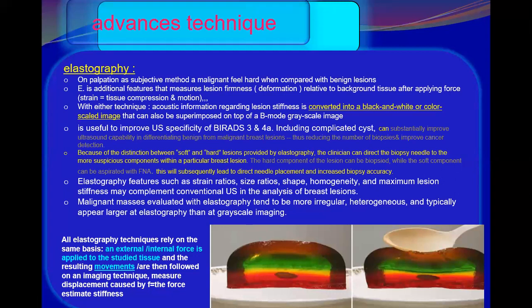Elastography has the same concept using the ultrasound machine, giving force to the lesion to see how it moves, how it displaces, and measuring this displacement or movement to estimate its stiffness.